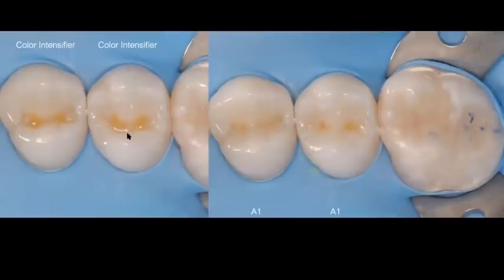You really don't want to use a whole bunch of this tint because, believe it or not, it shows through a lot. But I like using it. I like recreating nature. I like trying to make my teeth look real, and real teeth are not white A1, B1. Real teeth have a lot of color in them, have a lot of stains in them. Most importantly, posterior teeth. So I want to try to rebuild that for my patients. And there you can see I've added a little bit of the gold. Now that I've added my color intensifier, I'm going to do my second successive buildup, or cusp buildup, which in this case is the lingual cusp. So now I have both the buccal and the lingual inclines restored with composite.